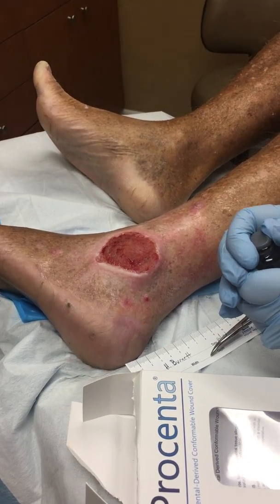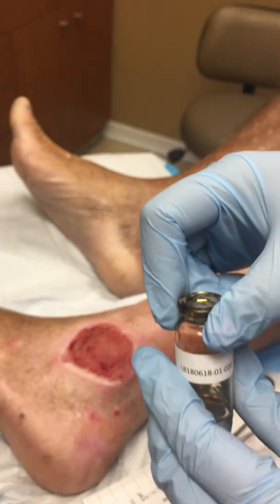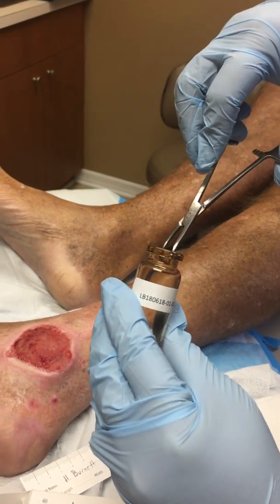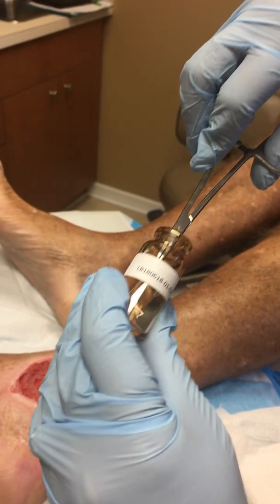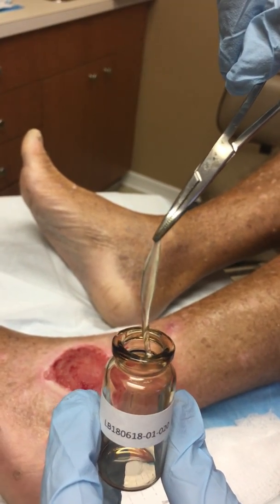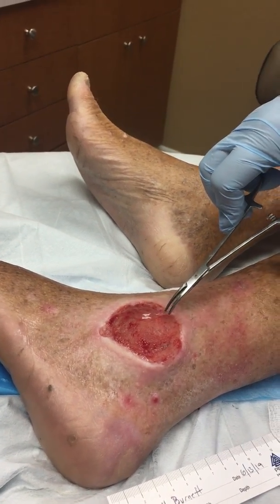The graft is right in there. We'll use a hemostat to hopefully be able to get that out. It's soaked in amniotic fluid and we're going to use three of these in here. This is what the placental graft looks like — very viscous.